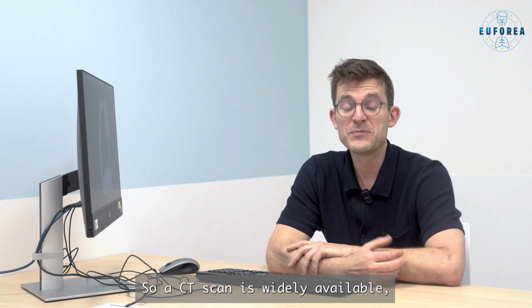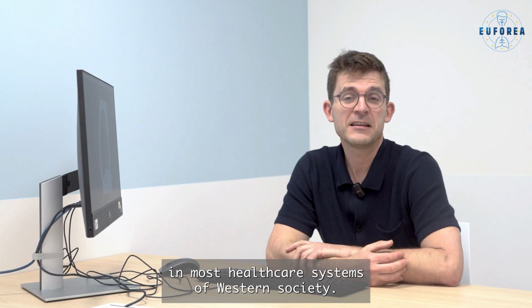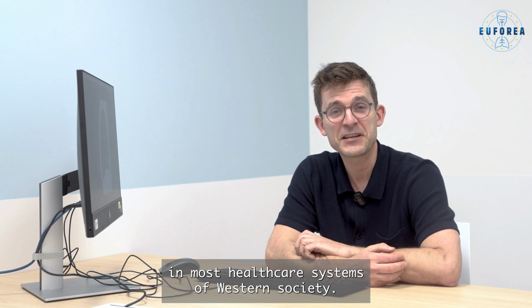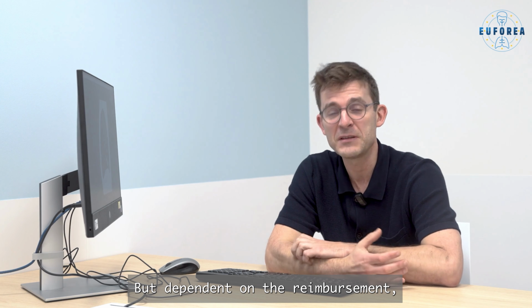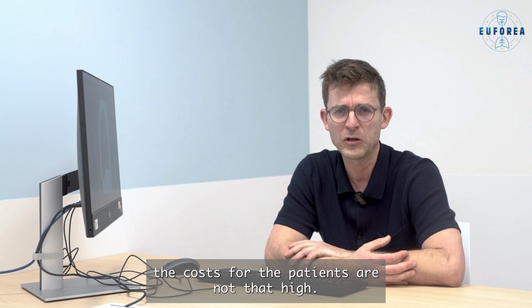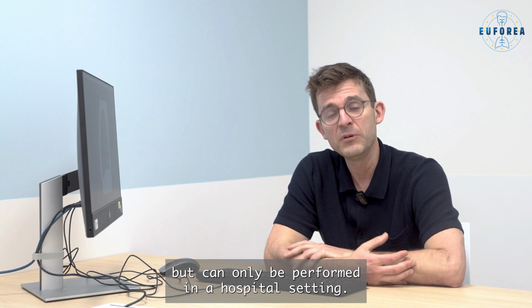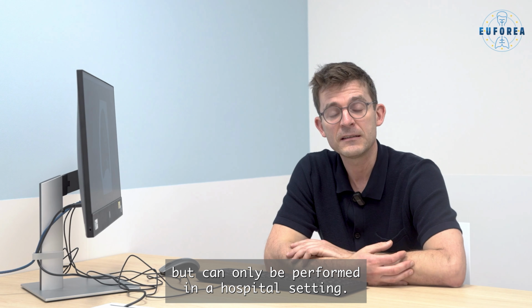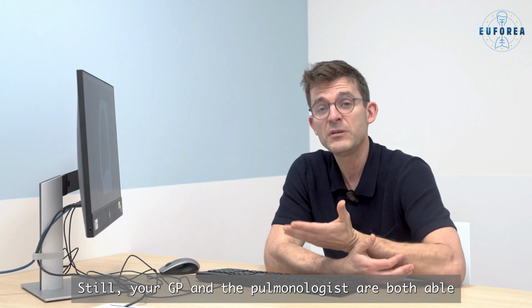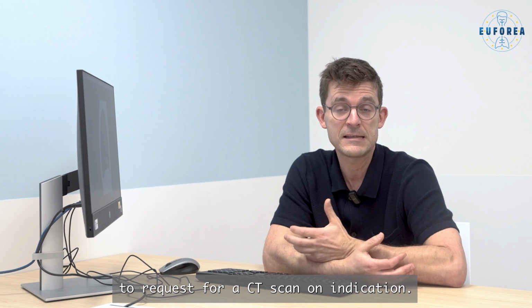So CT scan is widely available in most healthcare systems of Western society, but it's a quite expensive test. But dependent on the reimbursement, the costs for the patients are not that high. CT scan is an easy, quick test, but can only be performed in a hospital setting. Still, your GP and the pulmonologist are both able to request a CT scan on indication.